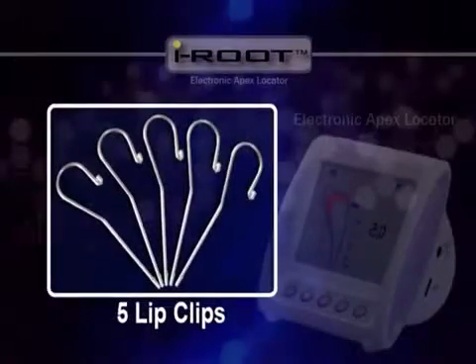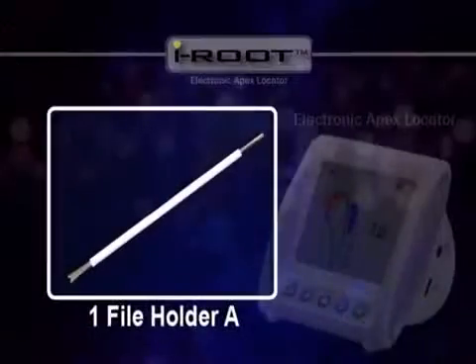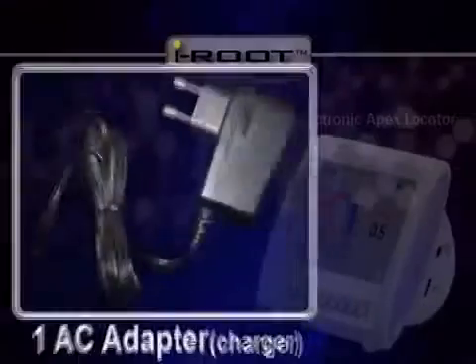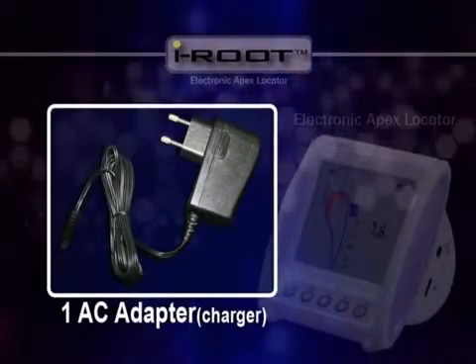Other parts included are 5 lip clips, 1 probe cord, 1 file holder A, and 2 file holder B — these connect the probe cord to the file. One power adapter is also included so that you can charge the unit.